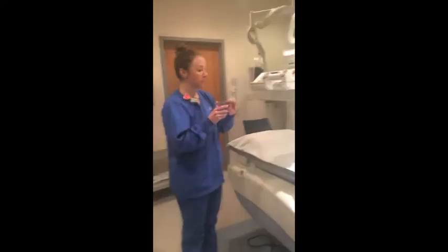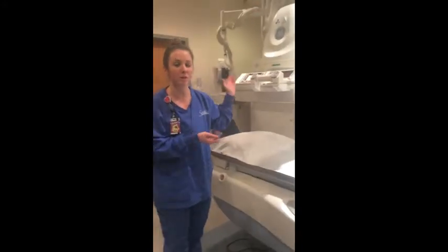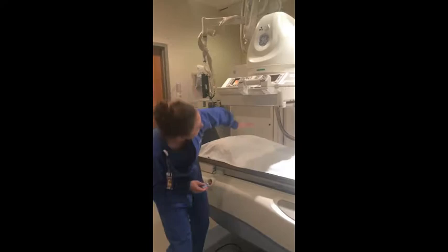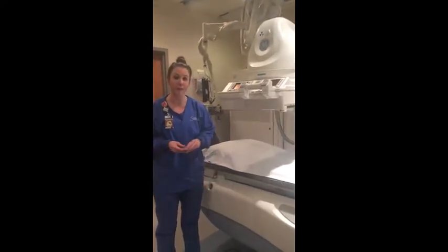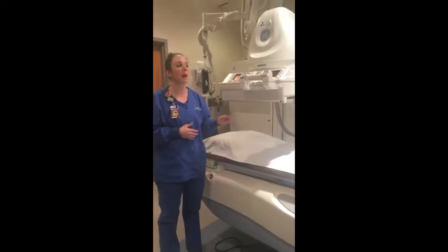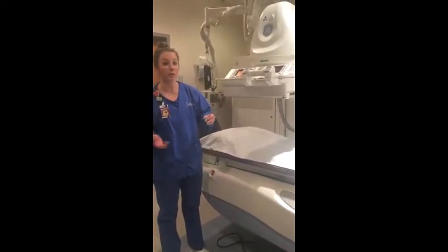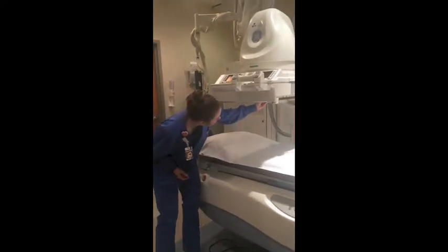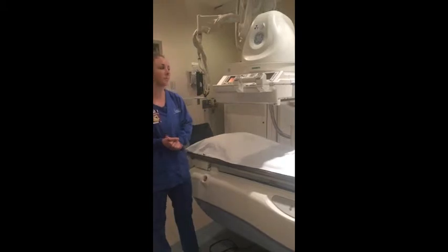The next thing I want you to pay attention to is the actual fluoro tower, or you can just call it a fluoro. There is a screen, which is very similar to the movie screen that I was referring to with the foot pedal. You need to mark either the left or the right side. So you'll take your marker, either your left or your right marker, and make sure that you put it on the screen. That'll stay there for the entire procedure.